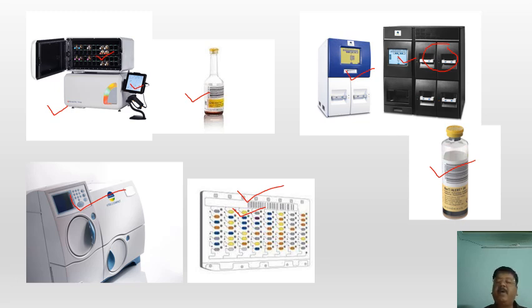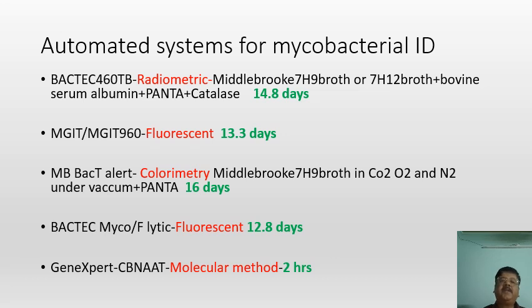For the equipment, it is a one-time investment. It may go up to 20 lakhs or even above depending upon the configuration. And then there is the recurrent cost of these consumables. So these are various machines.